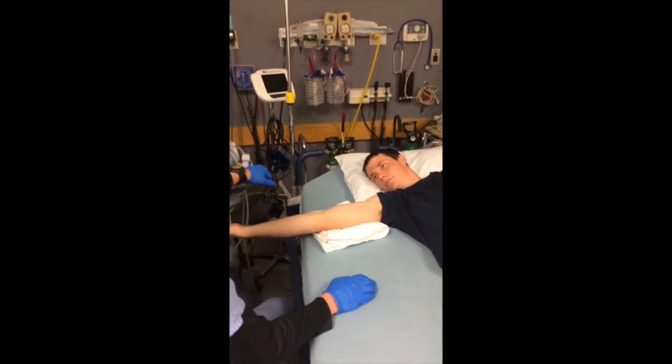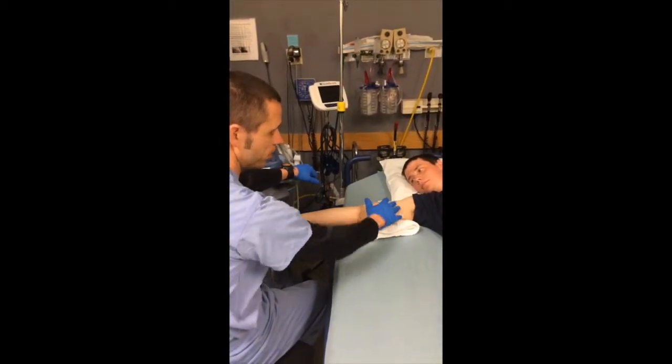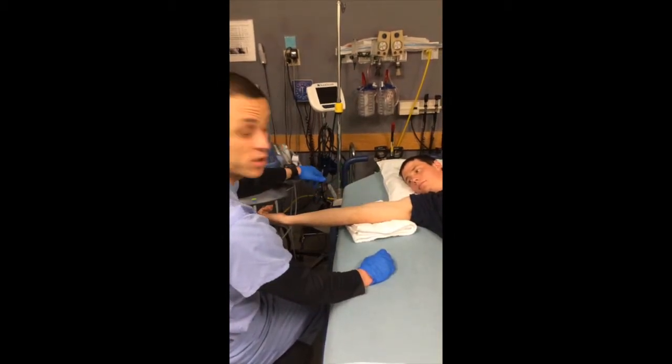Anytime you're putting in an IV, you generally want to try to start from lower and work your way upper. For the point of this video, I'm going to use the basilic vein or see what he has anyway.